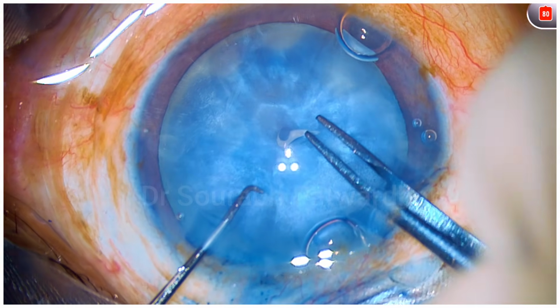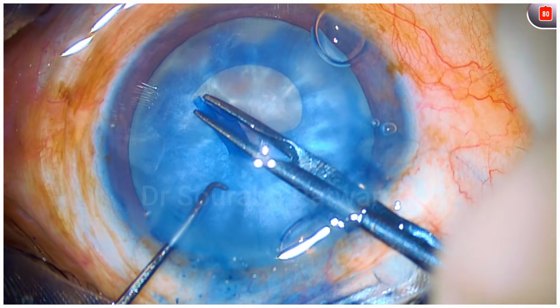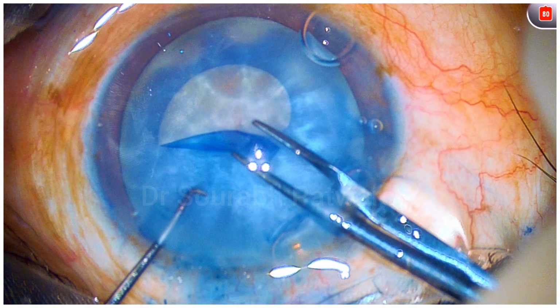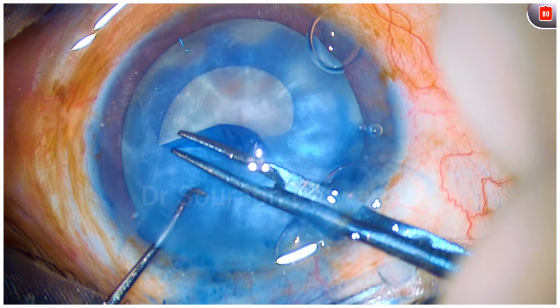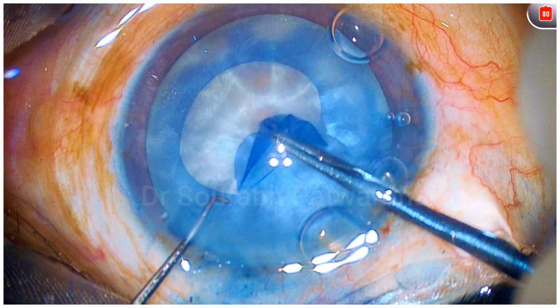The moment the flap is created, we have to imagine this 5 mm circle. We have to stay within this circle. So it's within the circle now, and now what you see is that it's going beyond this 5 mm circle. Once it goes beyond, there is a chance that it might extend further. So surgeon pulls it back, as you can see, it's pulled centrally and it comes within that 5 mm circle.